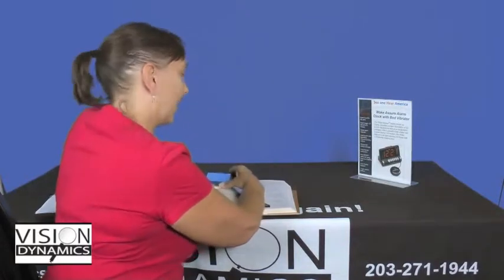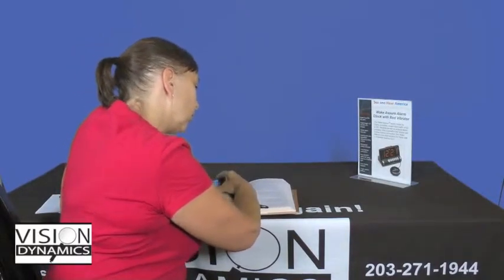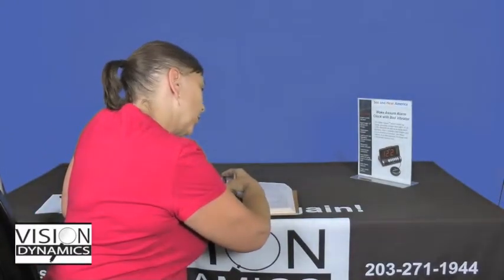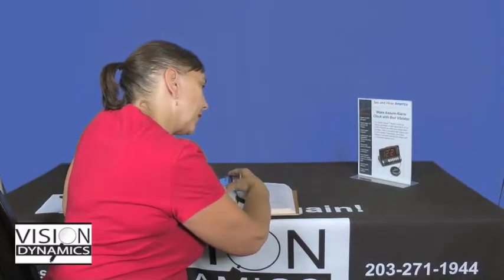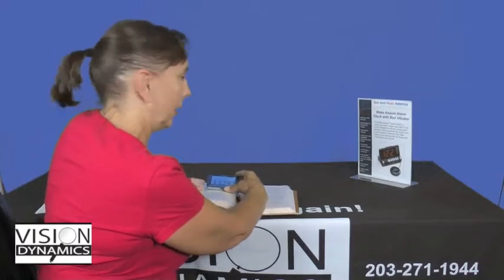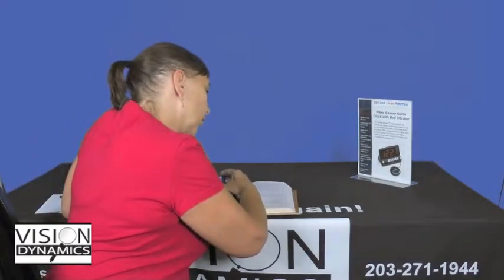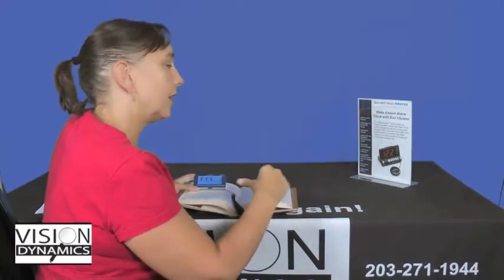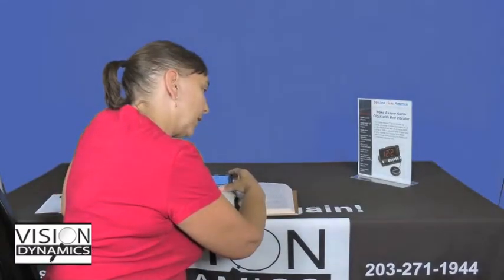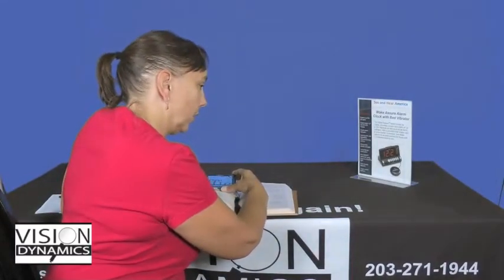Now it takes practice, learning to use the good field of view that I have, depending on what my eye condition is, whether I've got peripheral vision loss or central vision loss, coordinating that good field of view with the motion of sliding my video magnifier along. It takes practice and patience, just like if you used to use a handheld magnifier, the same thing used to happen. The nice thing with the stand is it's going to keep it nice and smooth for me as I'm moving it along.